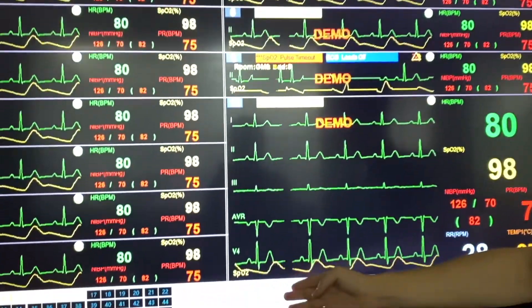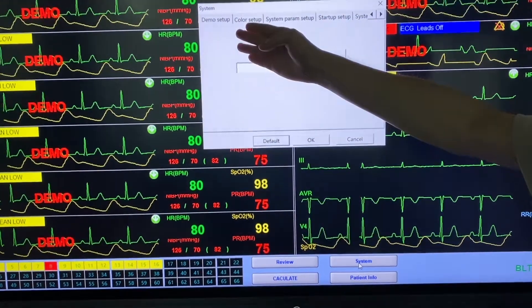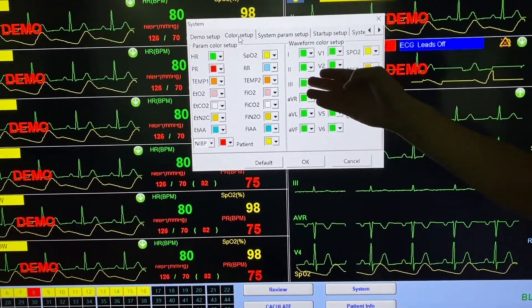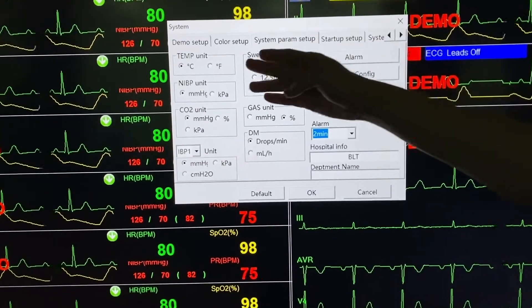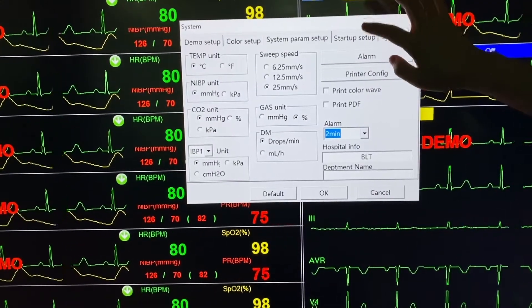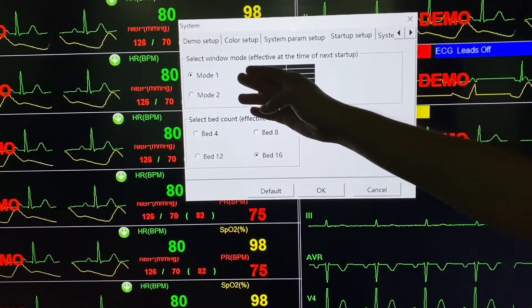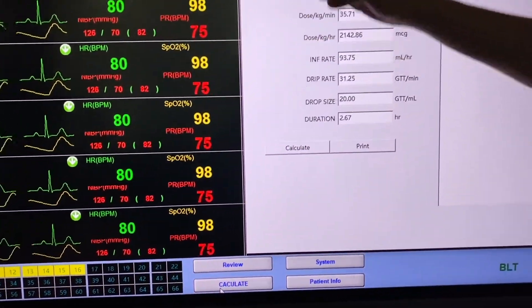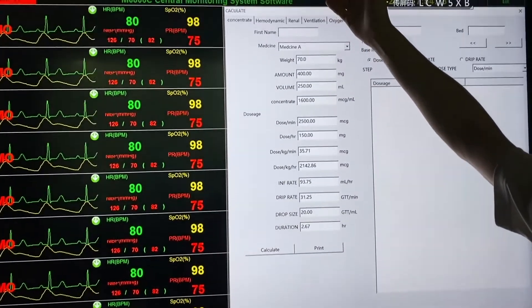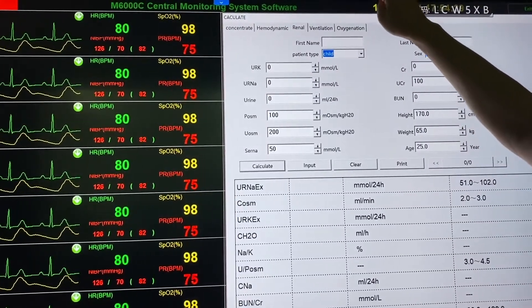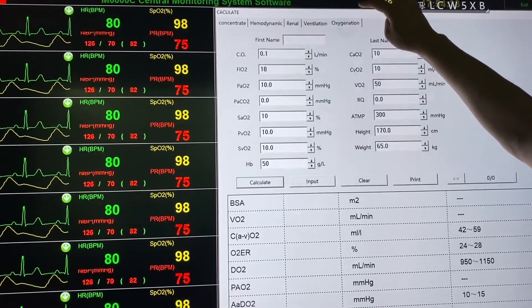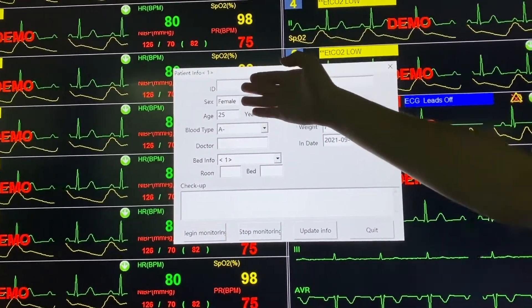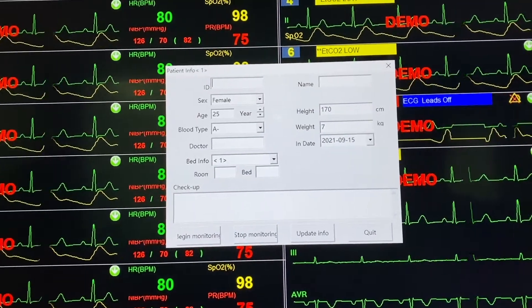We can click here to exit, and we also have a system setup. There is a demo setup where we can key in the passcode to go to demo mode. We can set up the waveform color for all waveforms and customize colors. We also have system parameters setup where we can choose units, startup setup to choose the display mode — mode one or mode two — and system maintenance. There is also a calculation function for drug concentration, hemodynamic calculations, patient renal function, ventilation and oxygenation calculations, and a quick key for entering patient information including patient ID, name, and gender.